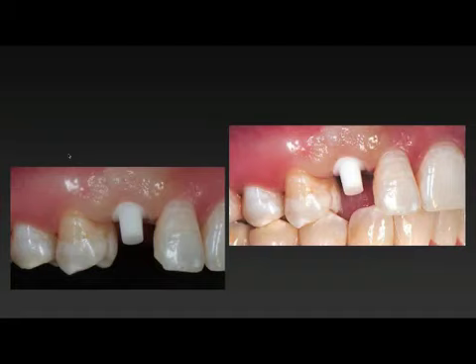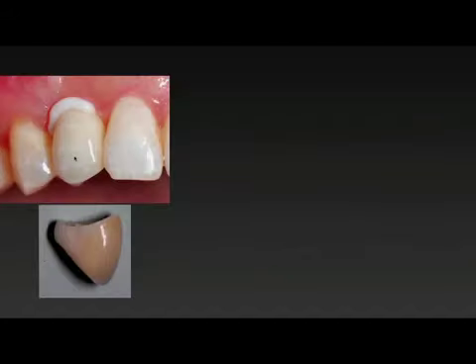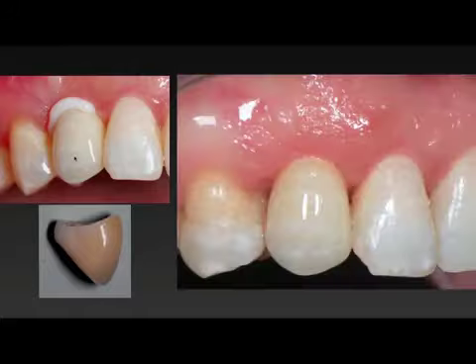And again, we can see that from the facial aspect. We have plenty of restorative space, absolutely no need to prepare this abutment. This is a radiograph in place, and we simply take an impression 3 months after, and we're able to cement a beautiful crown for the patient and have a fantastic result that was really, really simple to achieve.